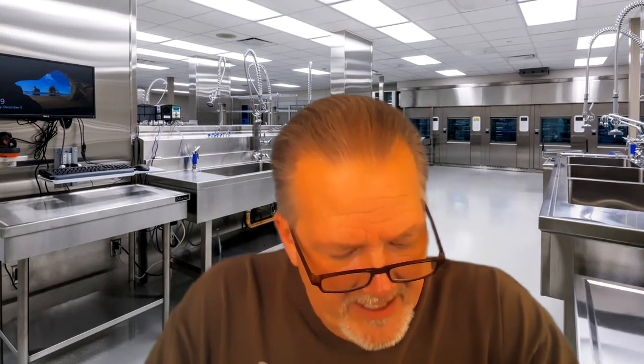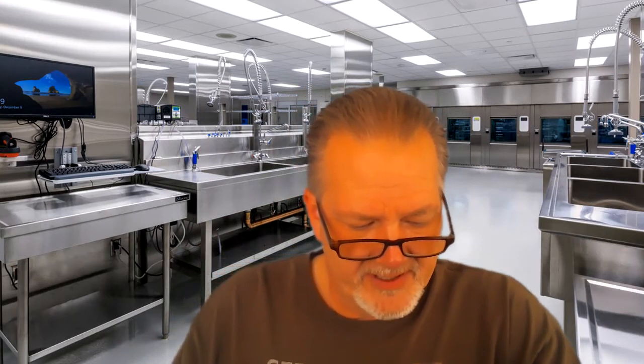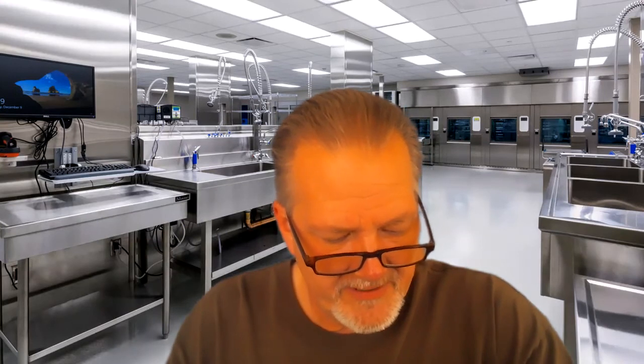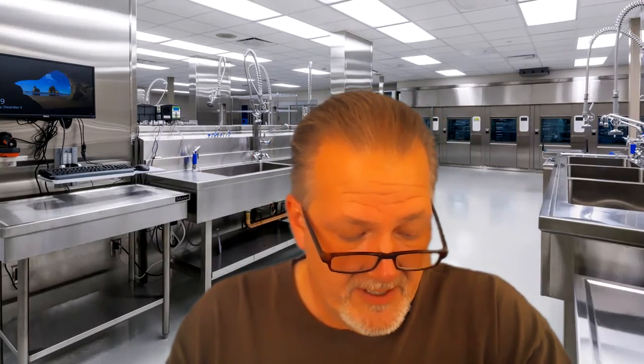Okay. Contaminated items from other departments are often placed in a holding area for pickup on a scheduled basis by a CS tech, who then returns them to the decontamination area for processing. Soil pickup rounds should be performed as scheduled. If you fail to do soil pickup rounds as scheduled, you could be setting yourself up for a shortage of equipment and instruments.